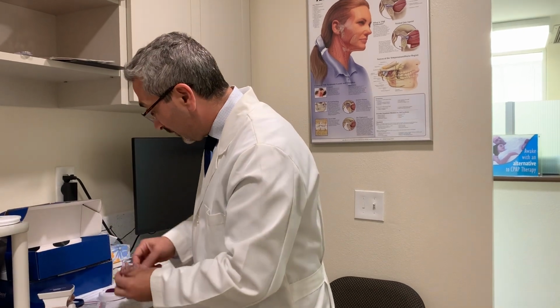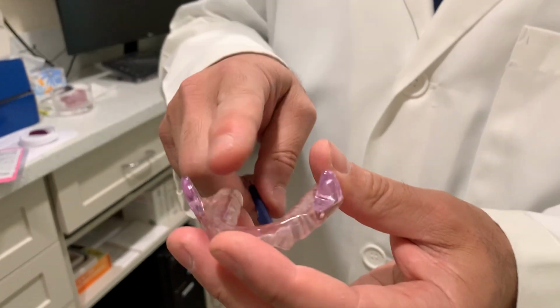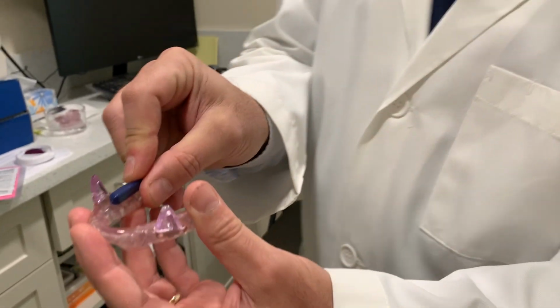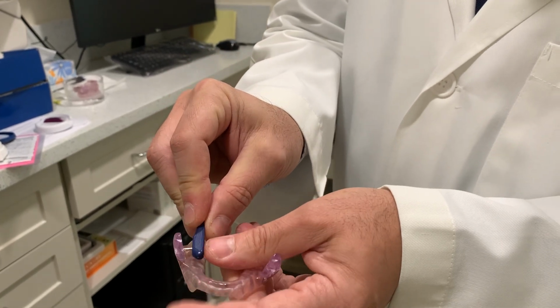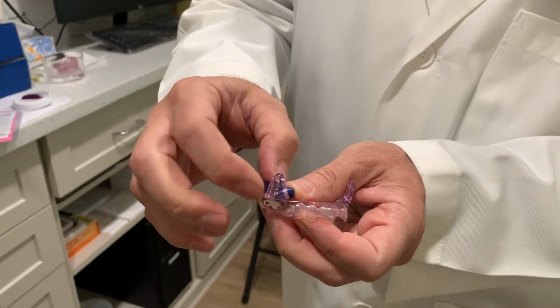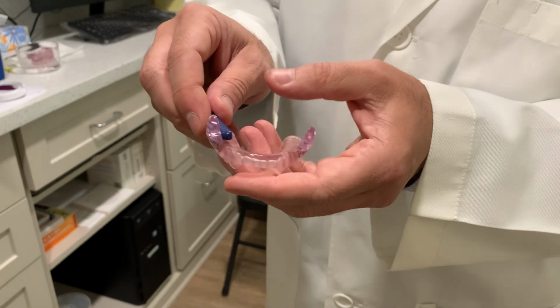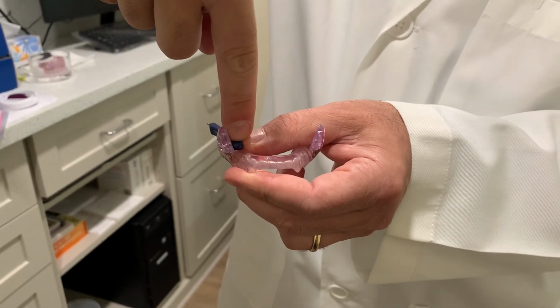And so what you're gonna do is you're gonna take this key, you're gonna lay it flat against the teeth on the inside and fit it inside the hole here. With both thumbs and index, you're gonna be pressing and squeezing until that key goes all the way through. Once it's in, I'm gonna use my other thumb to keep pressing it in as I stand this key up.